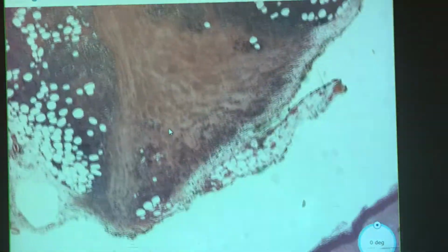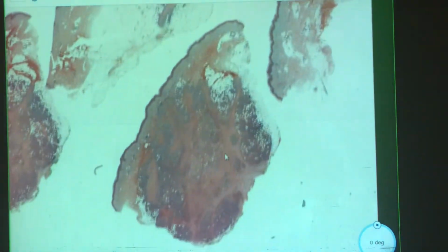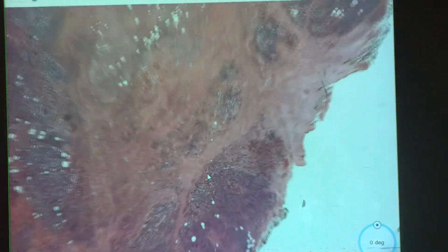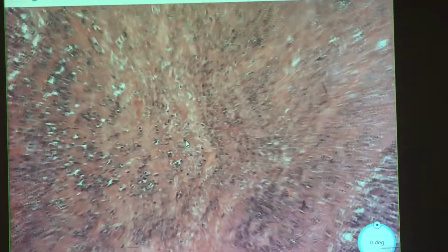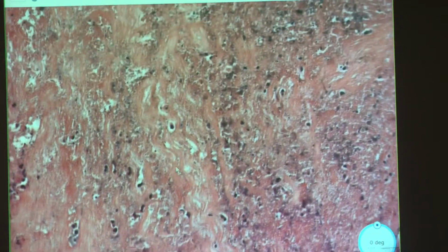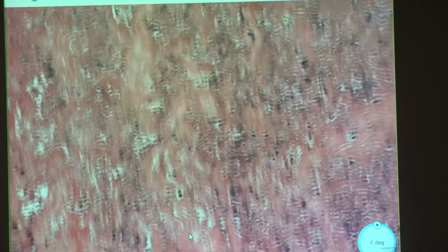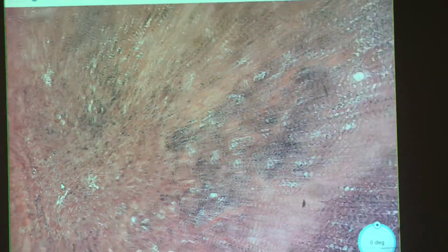I feel like this would differentiate this one from the previous one we saw. Is this weird dead thing, this thing here? I feel like the necrotic area. Yes. I feel like this is the part that we need to focus on for this diagnosis, although I don't know what I'm looking at. Okay. Collagen? Maybe in there. But anyways, it's something dead.